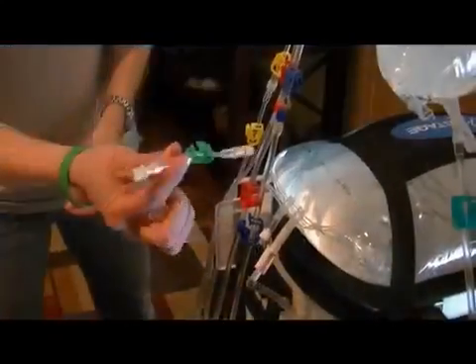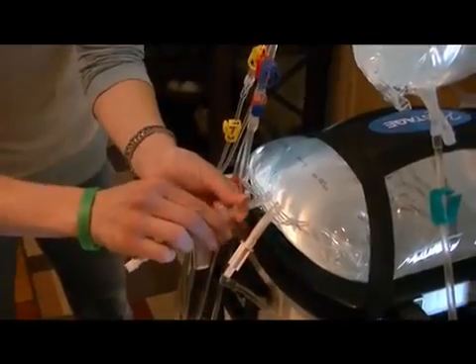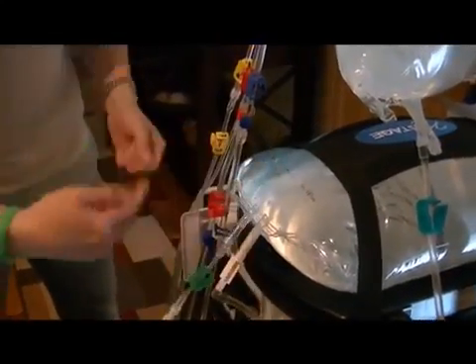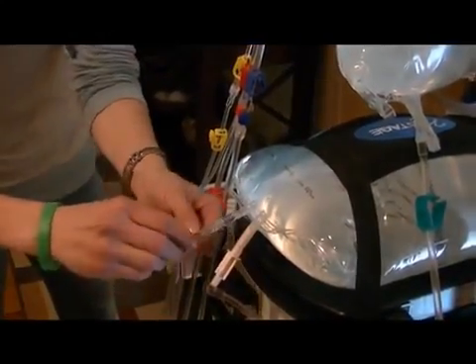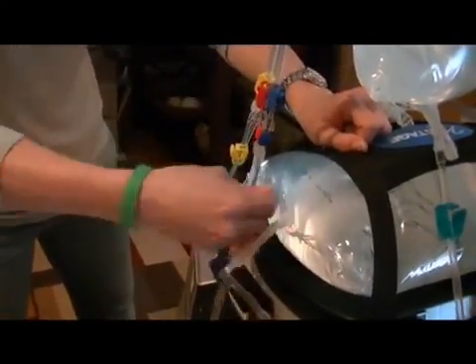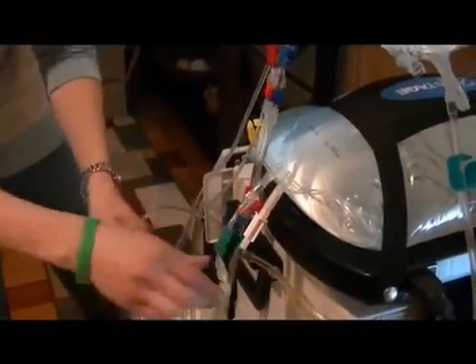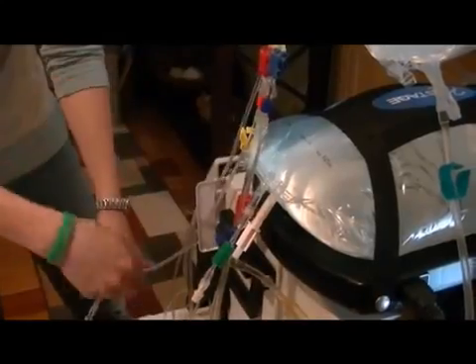Okay, this is the connector piece that we hook to this bag and how we will hook the dialysate up to the machine. So you clamp it, break it, and then whenever we get ready to do the machine, this piece will hook up, and that's how the dialysate will actually get through the lines.